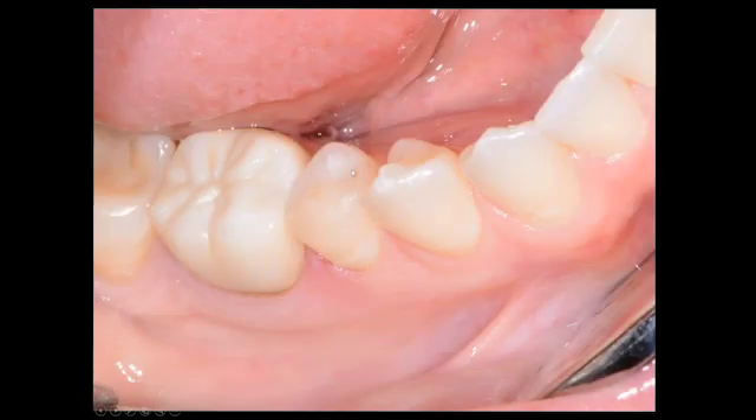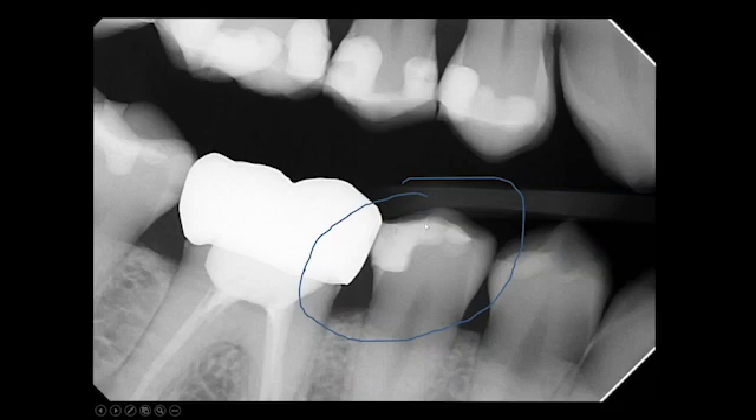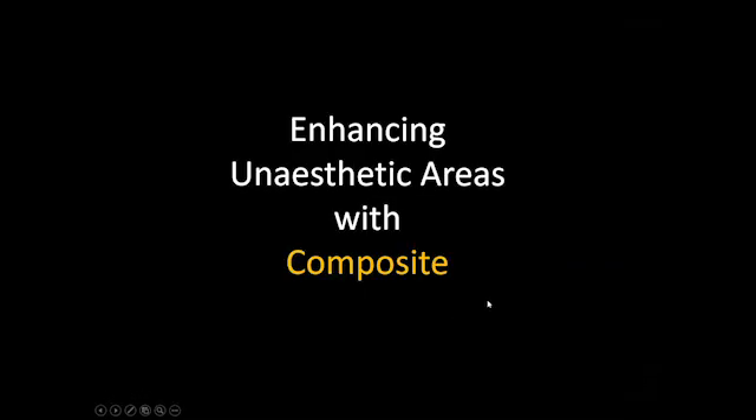We cure this, take our discs and polish. If any occlusal adjustment is necessary we'll go ahead and do that. Here we see the Wago Fill — just one opaque material — used for a class two restoration with a nice contact and nice anatomical form. Compare this with other restorations done prior to this patient coming to our office; you can see poor contacts with other composite restorations. Using the Wago tricks and Wago Fill system, we're able to get really nice contours, and I feel confident that material will last a very long time because it's infused with zirconia.